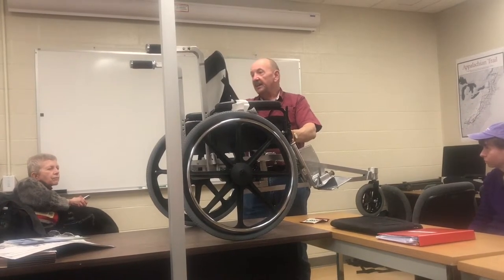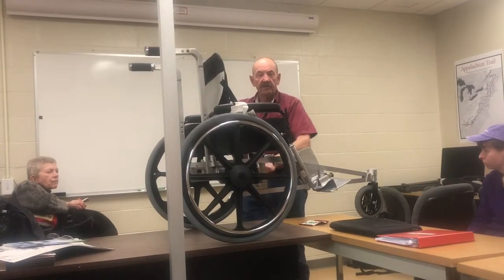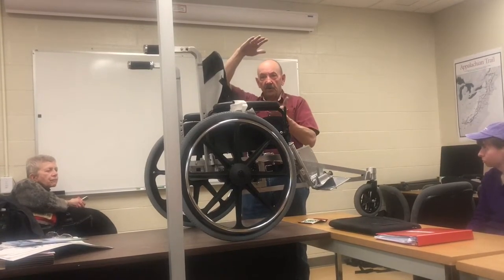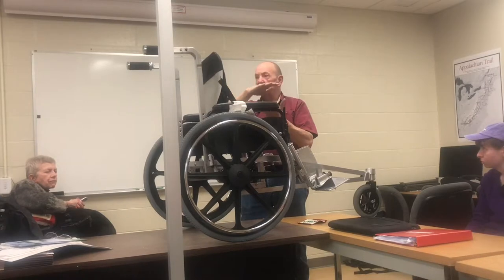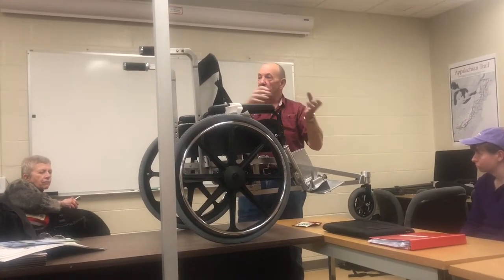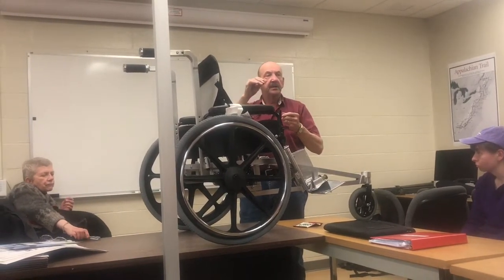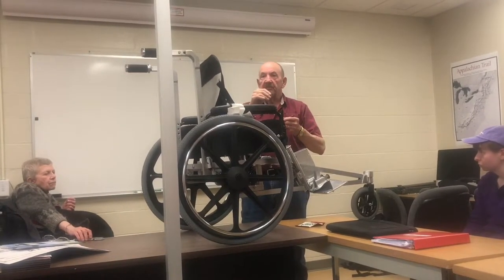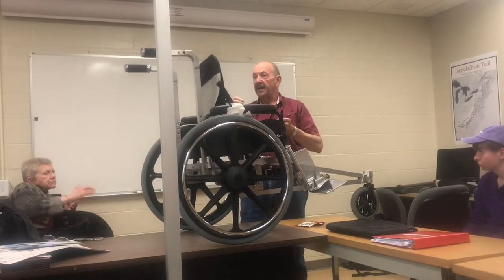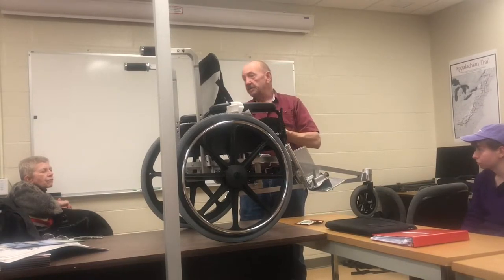It just changes the seat height. There's a little valve that controls what happens when you compress the shock absorber — oil flows from one chamber to the next. If you adjust the valve to increase or decrease the flow, it increases or decreases the level of cushion in the seat.